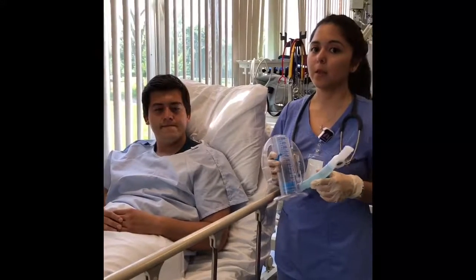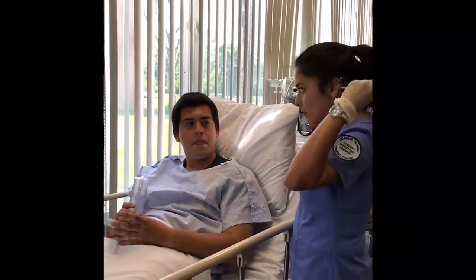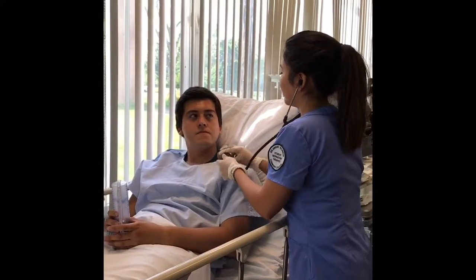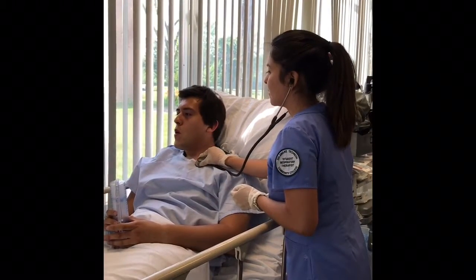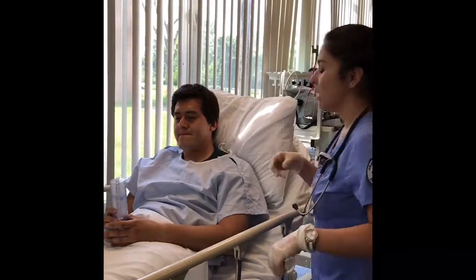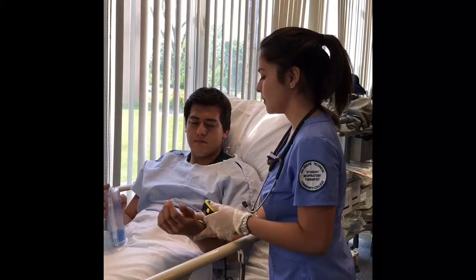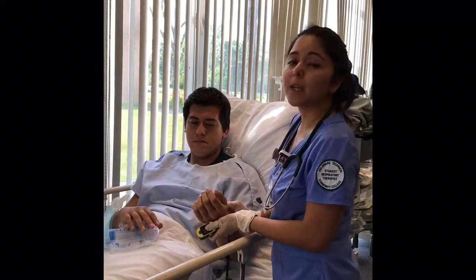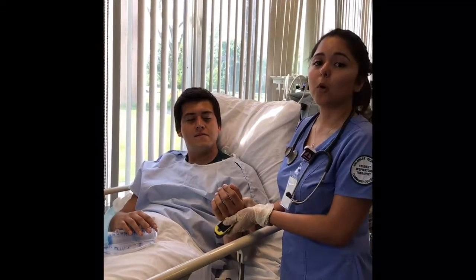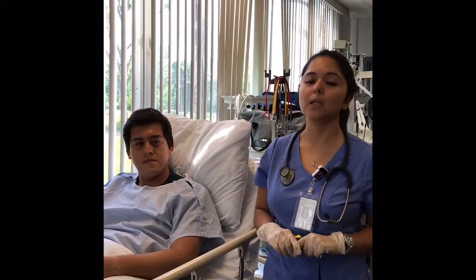Outcomes of IS therapy include improvement in abnormal breath sounds. It also includes a decrease in the patient's pulse rate, respiratory rate, and an improved breathing pattern. IS therapy will also provide better oxygenation and would improve the patient's vital capacity and inspiratory capacity.